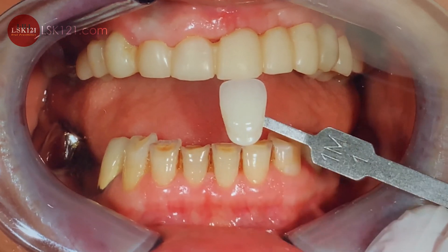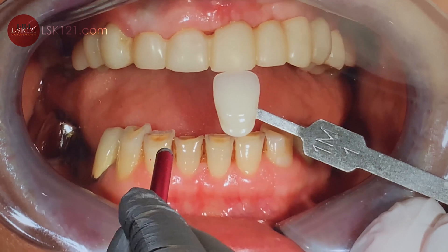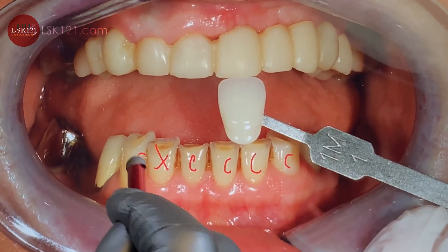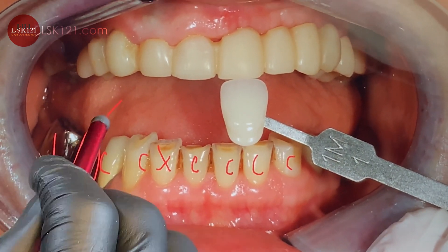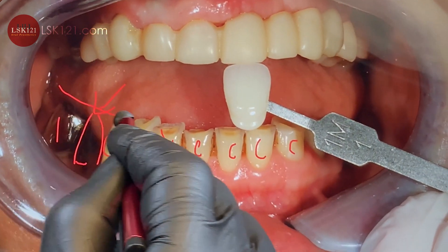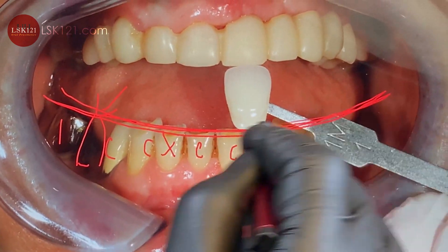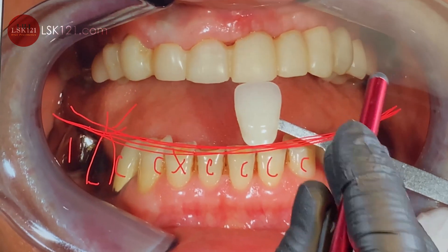The patient selected color 1M1. We're going to make crowns across the upper arch, and here will be the implant side. I have to check the occlusion curve carefully — that's really tough — and then open the bite and finish it.